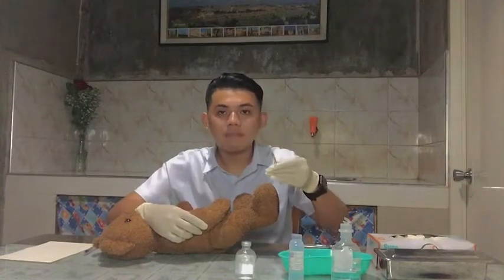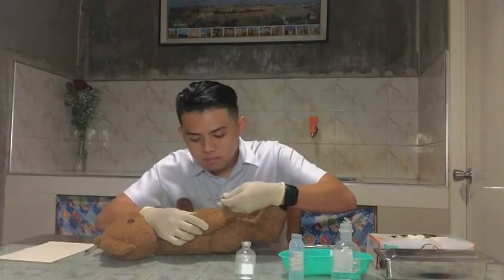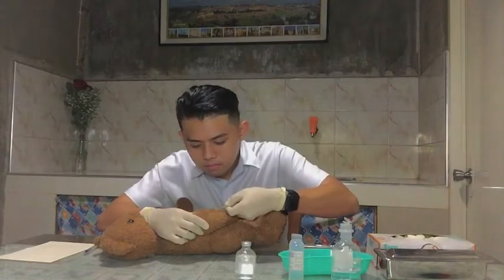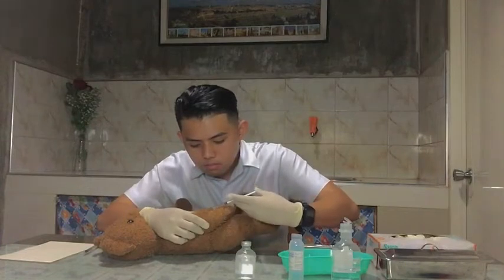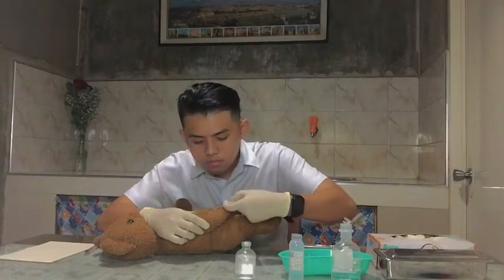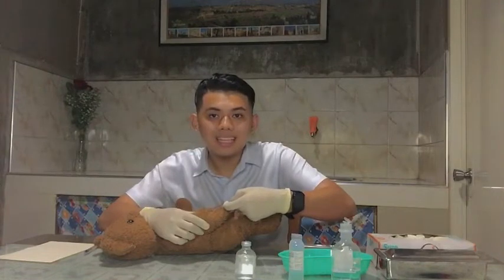Now insert the tip of the needle far enough to place the bevel through the epidermis into the dermis. Stabilize the syringe and needle and inject the medication carefully and slowly so that it produces a small wheal on the skin. If a small wheal appears, all the solution is in the intradermal tissue, and after that, withdraw the needle quickly at the same angle at which it was inserted.